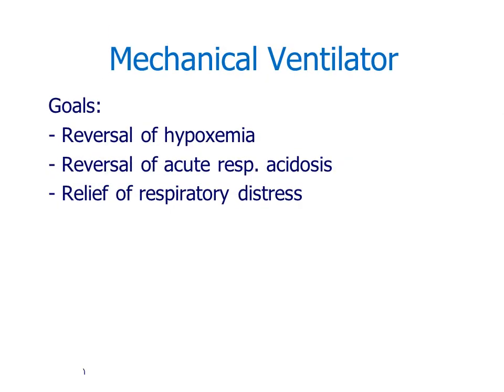Mechanical ventilator. The goals for using a mechanical ventilator are to reverse hypoxemia, reverse acute respiratory acidosis, and relieve respiratory distress. It's not used to treat, but to support the respiratory function until the underlying cause is treated.